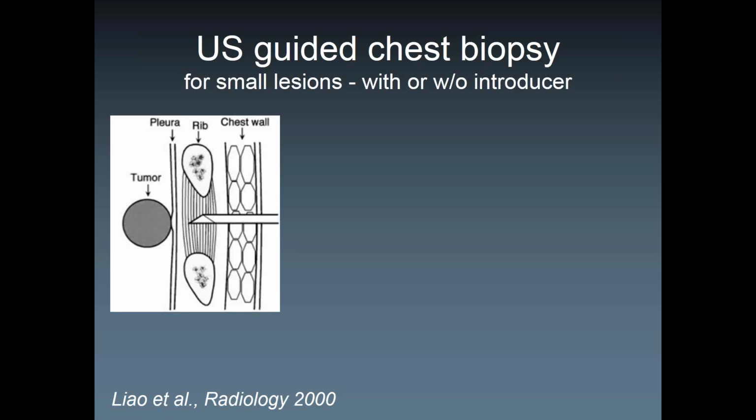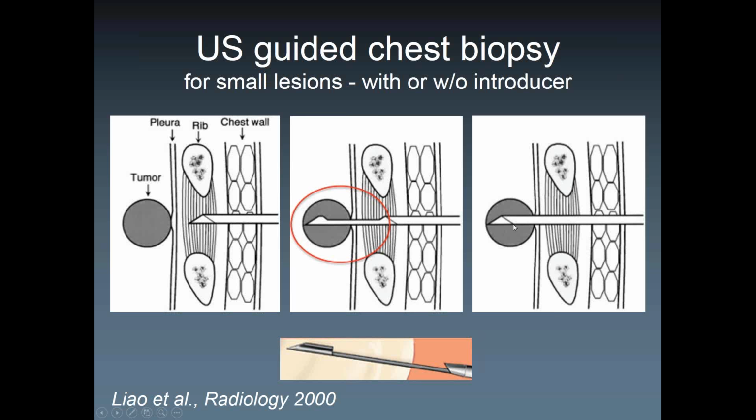So you want to do anything you can to do a lesion with ultrasound guidance. And this technique, which is actually published, is pretty nice. It's ideally done with the side notch technique, where you have a thinner trauma through the pleura here. If this would be the pleura here, this one there, right? You can navigate the device into the lesion while minimizing the trauma. And then you fire into the lesion with the trough secured in the target beforehand. Here's an example.